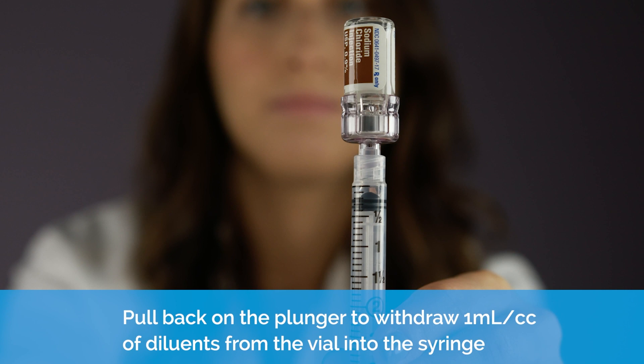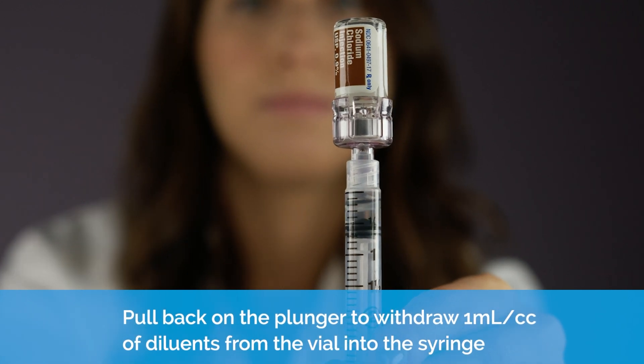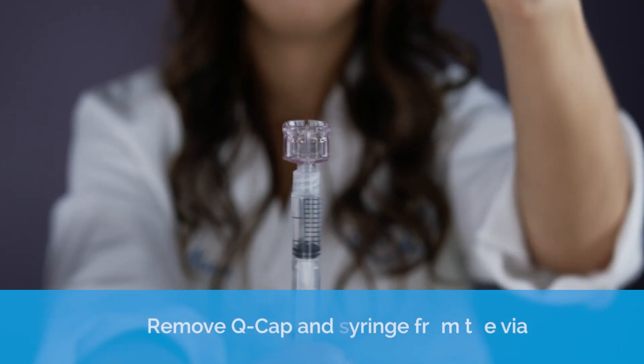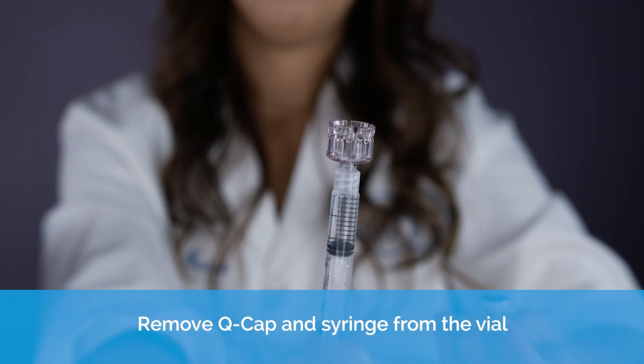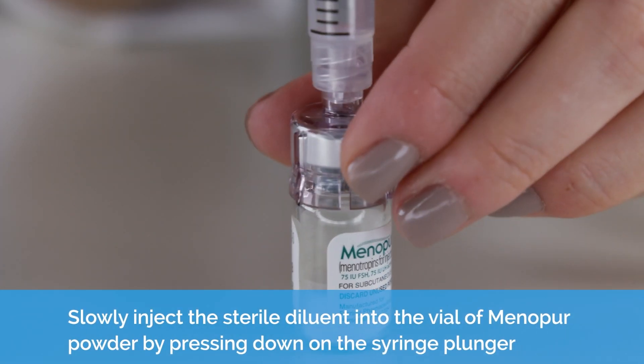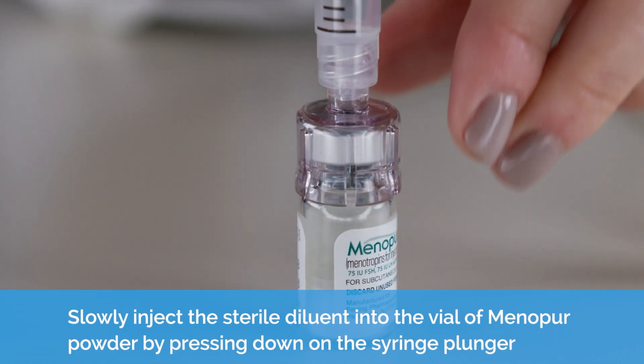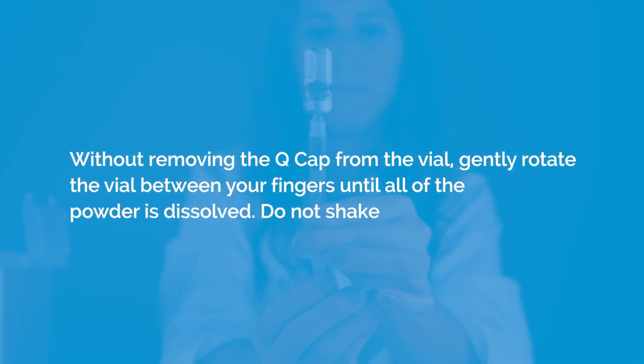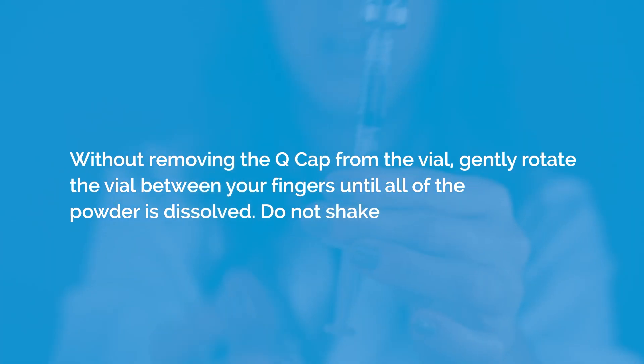Pull back on the plunger to withdraw one milliliter or one cc of sodium chloride from the vial into the syringe. Remove the Q-Cap and syringe from the vial. Without removing the Q-Cap from the vial, gently rotate the vial between your fingers until all of the powder is dissolved. Do not shake.